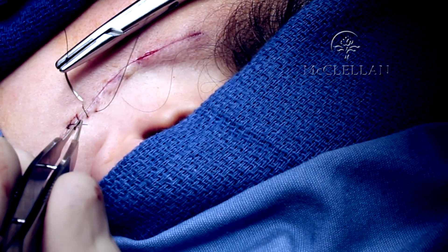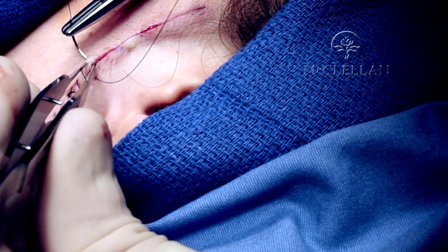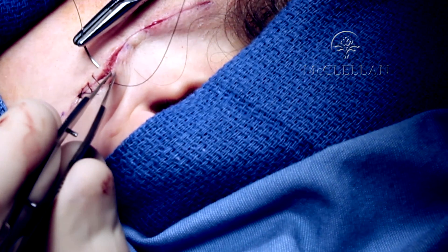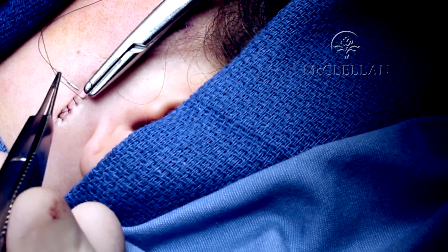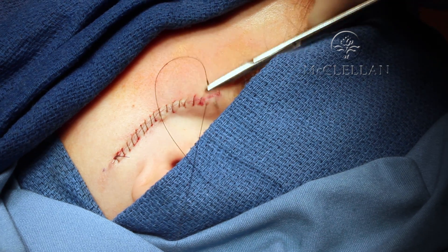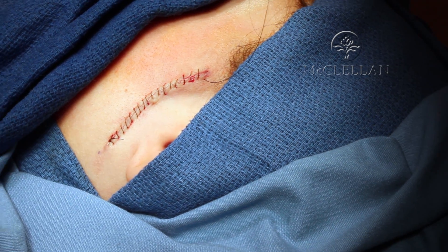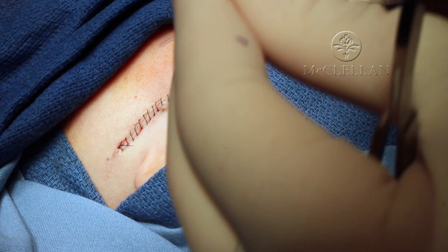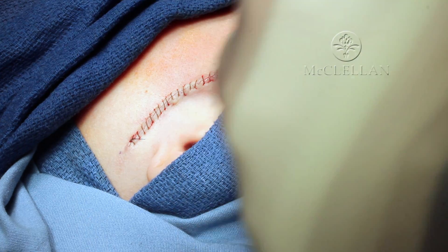Generally I sew from away from myself toward myself. One final throw here — through and across. Notice I'm very gently lifting the skin up with my small forceps; these are 0.3 forceps. Here I am at the final edge of the wound. I'll take one more bite. I can pull up just on the leading suture edge and come straight across as you develop the tension across the suture all the way down.